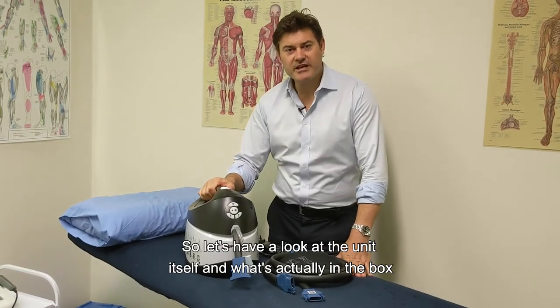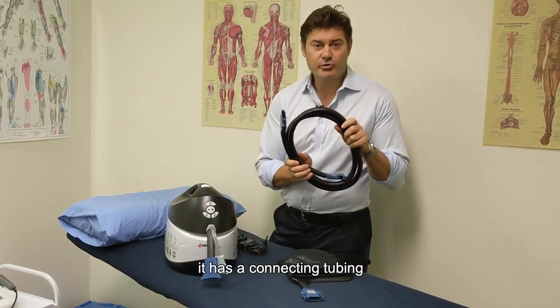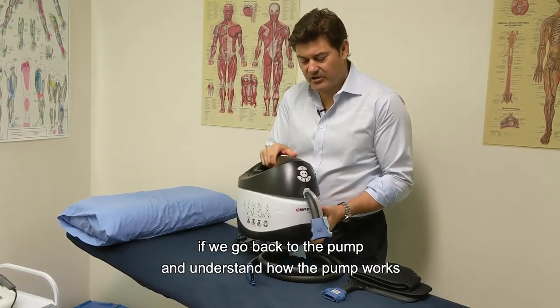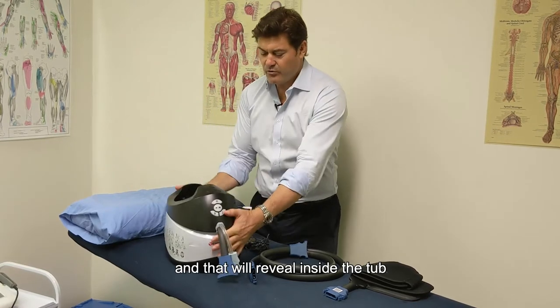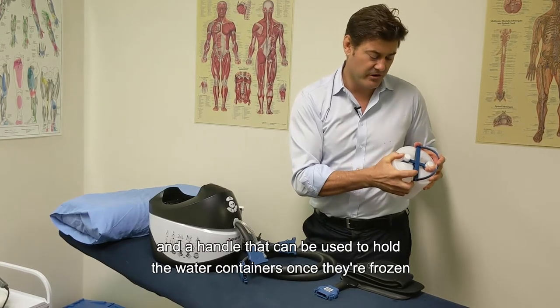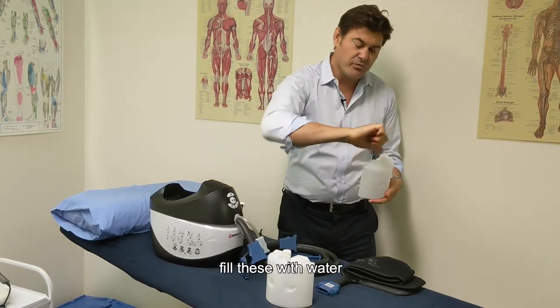Let's have a look at the unit itself and what's actually in the box. The Breg V-Pulse starts with the pump itself — it has a power source, connecting tubing, and a personalized wrap specific to the injured body part. To understand how the pump works, turn the lid to the eleven o'clock position and lift it off to reveal water containers inside the tub that need to be frozen, along with a handle. Simply detach the water containers from the handle.